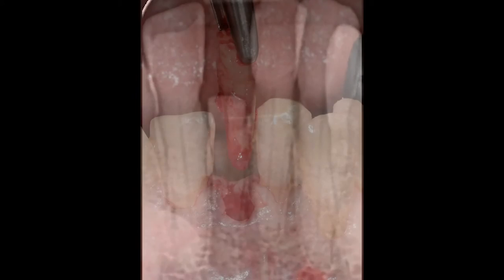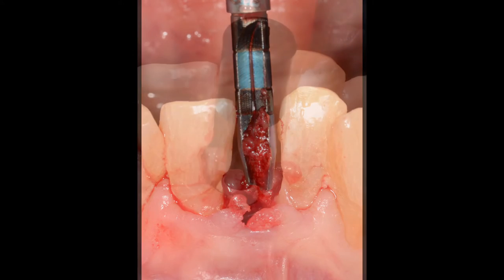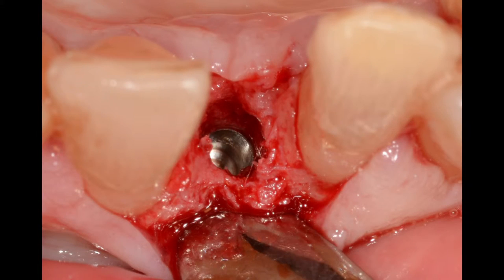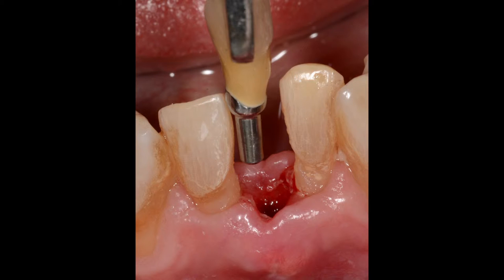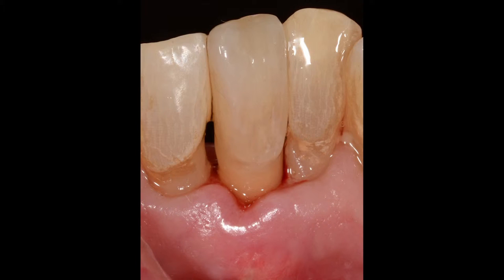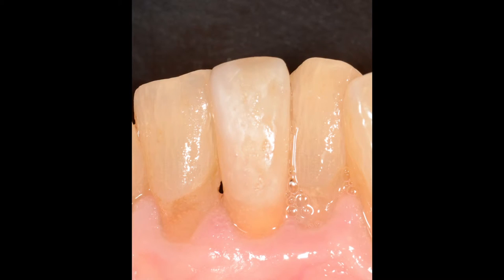Our second case is the immediate replacement and restoration of a 3-millimeter narrow implant to replace a single mandibular incisor for a 70-year-old female. Clinical and radiographic images reveal not only the excellent aesthetics of an integrated abutment crown, but more importantly, they show how the interdental papillae around Bicon implants can improve significantly over time.